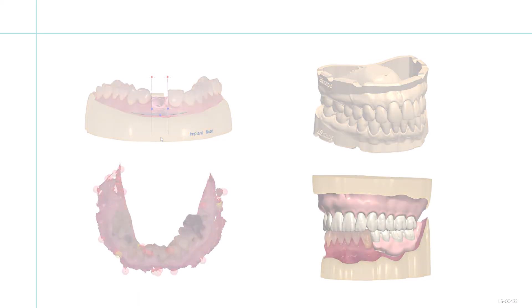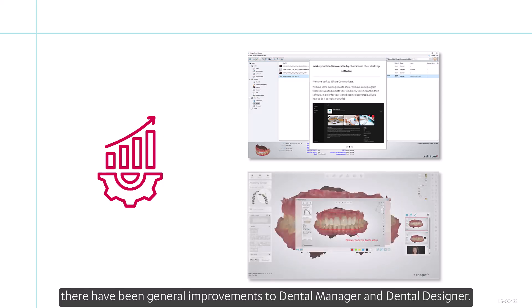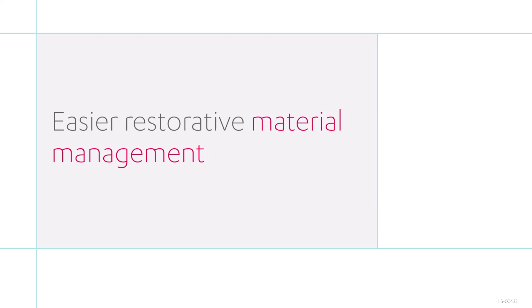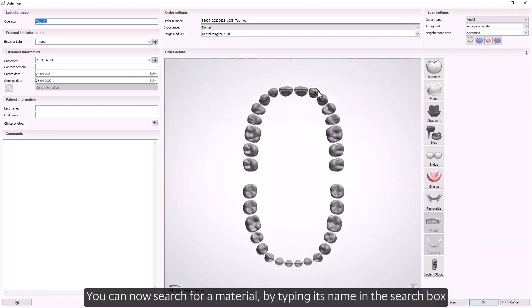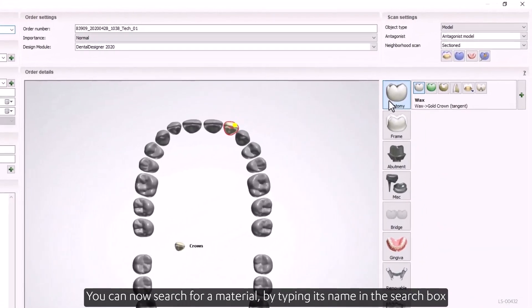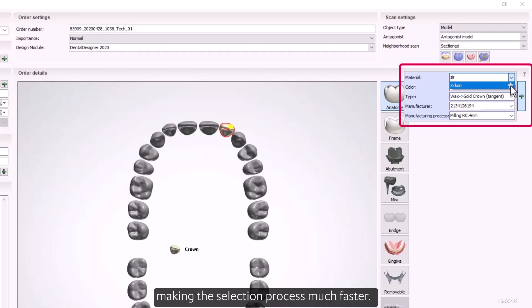Apart from improved speed and stabilization across the whole system, there have been general improvements to Dental Manager and Dental Designer. Over the years we've been optimizing material management — you can now search for a material by typing its name in the search box and mark restorative materials as favorites in the order form, making the selection process much faster.